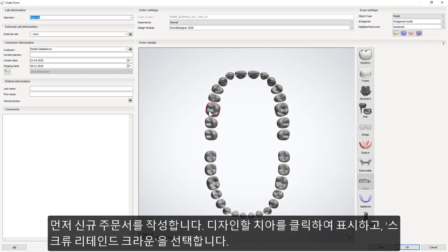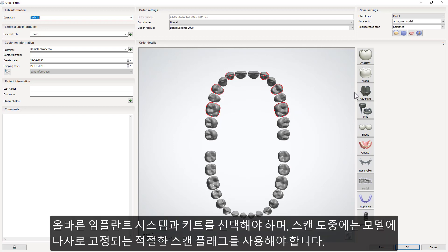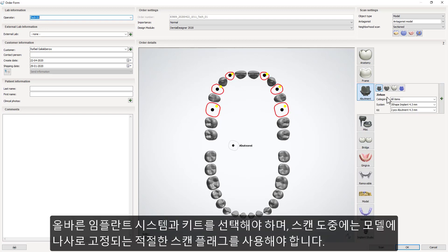Start with creating a new order. Mark the teeth you're going to work on and select Screw Retained Crown. Select your material of choice — in our case, we're choosing Zirconia. Remember to choose the right type of implant system and kit.